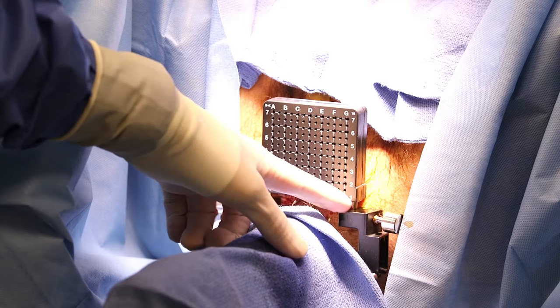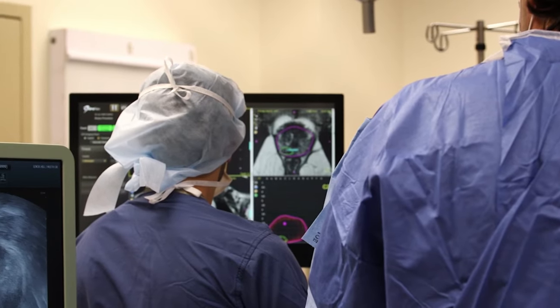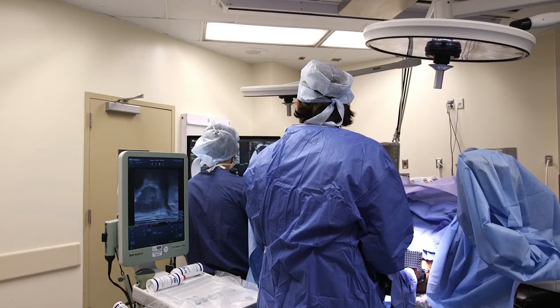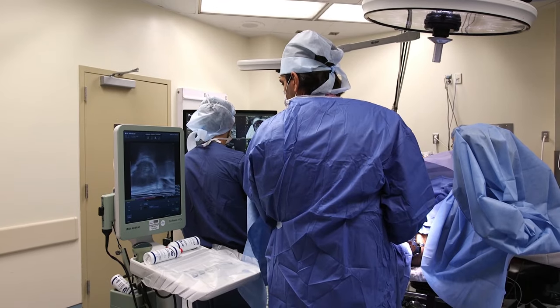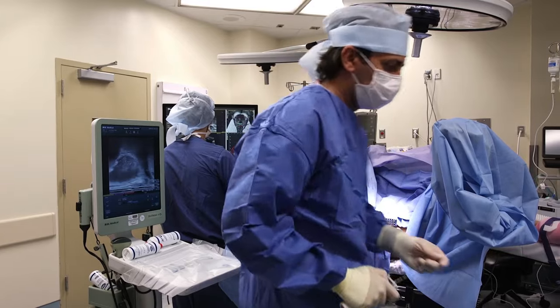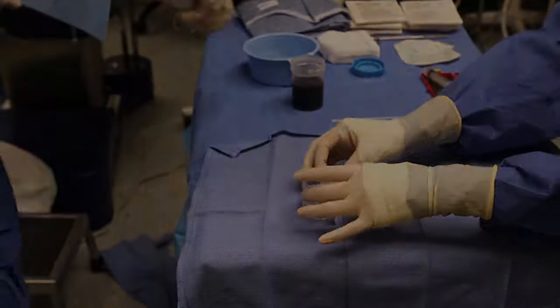The grid plate is then attached to the stepper after the administration of local anesthesia. The grid plate pins are secured on each side. Prostate ultrasound and MRI segmentation is then performed, which is featured later in this video. We can now begin obtaining prostate biopsy specimens. The desired biopsy location is selected on the Euronav system and visualized in real time on the ultrasound machine. The biopsy gun is inserted through the selected grid plate hole and fired once the location is satisfactory.